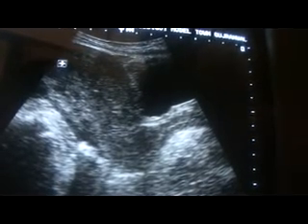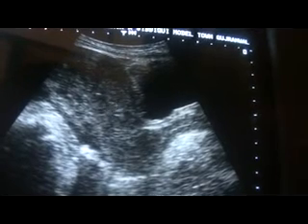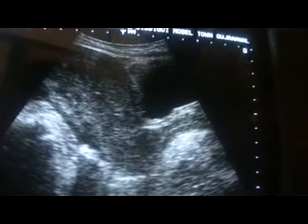Now, this is a small amount of fluid with echoes posterior to the uterus. This area from here to here is fluid with internal echoes.